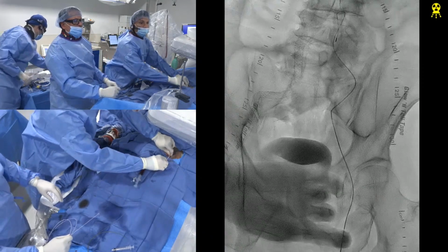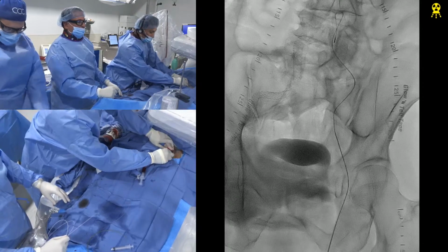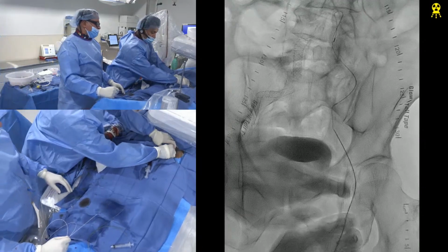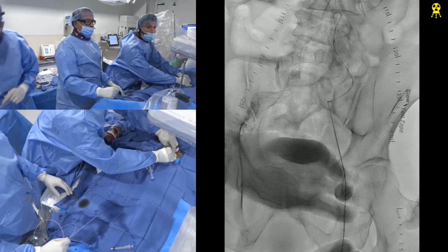We have non-invasive imaging on this, but axial imaging with the CAT scan, we don't normally do that, Raman. Generally speaking, for these cases, unless we have aneurysm work along with this, I think you need a stiffer. Can you get it in or no? Yeah, I got it. I can help.